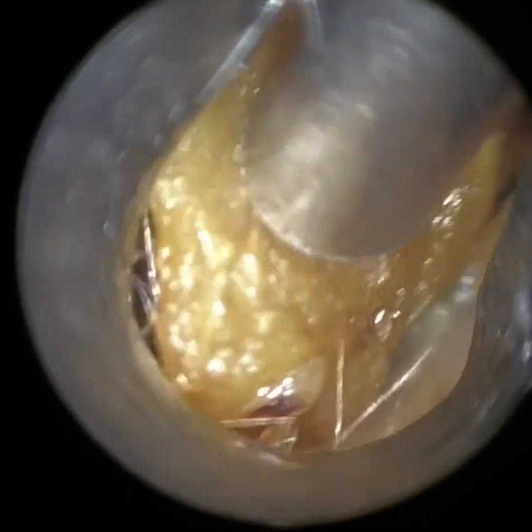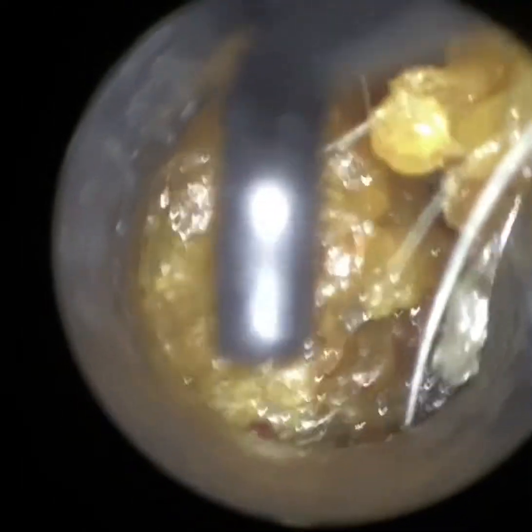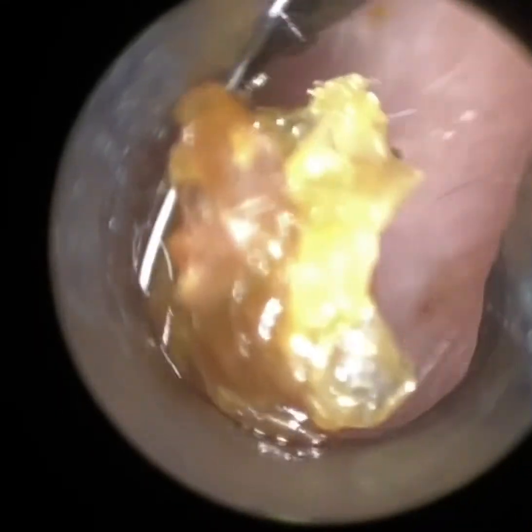The patient is quite astonished at the end of the procedure. They actually got some of these plugs of wax and skin and rubbed it between their fingers and saw how hard it was. This is a very good case to do with the wax kit because it's one of the more complex ones. Typically I don't recommend clients use any drops prior to attending, but I've only got about one in a hundred clients that I do recommend drops for, because I know it's going to benefit the procedure — and without using the drops, it's going to be very difficult.